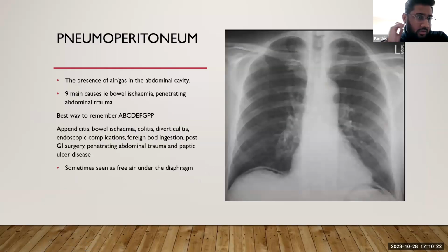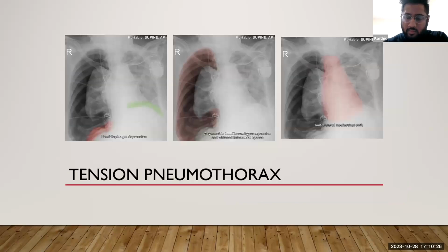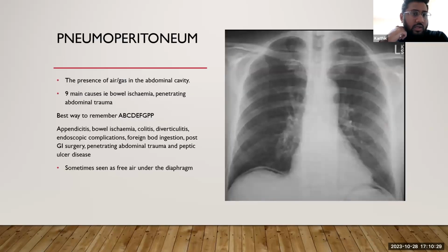Okay, so pneumoperitoneum typically would need an abdominal X-ray and chest X-ray to identify this, but normally we'd get a chest X-ray, and rather than doing an abdominal X-ray, we go straight to CT if it's readily available, but sometimes we obviously get the abdominal X-ray as well.